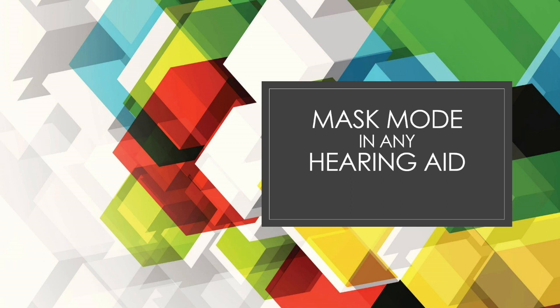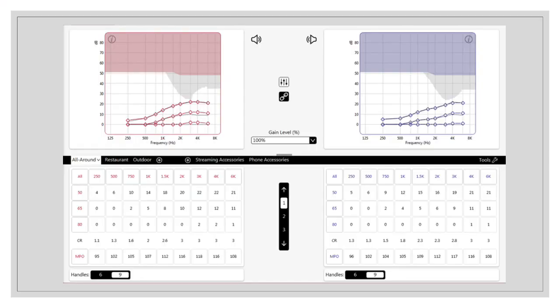In the previous video, we have seen how different masks affect speech, which frequencies are affected, and how much is this attenuation. In this video, we will see how to overcome them. Before I directly take you to the values that need to be changed, I'm going to give a brief overview of the parameters available for us to change in the hearing aid software. This is a screenshot of one of the hearing aid software. The options available here are almost similar to the ones that you have.